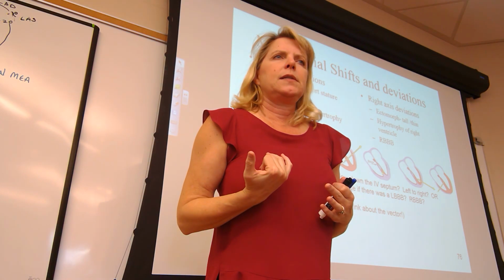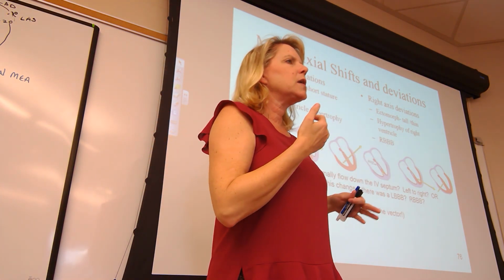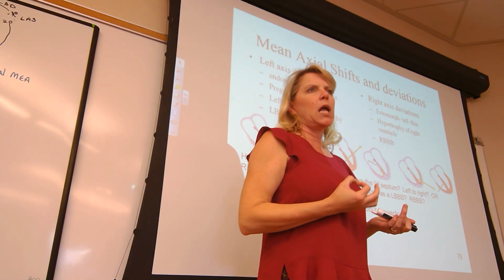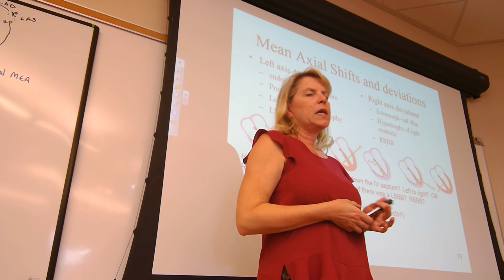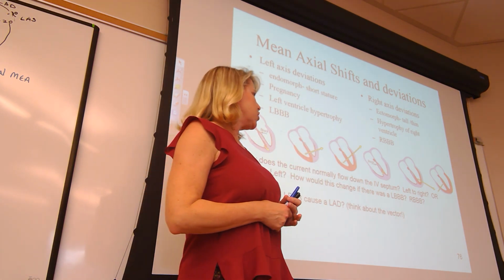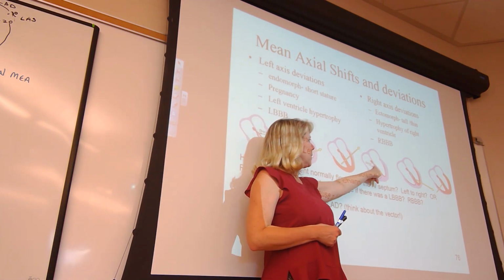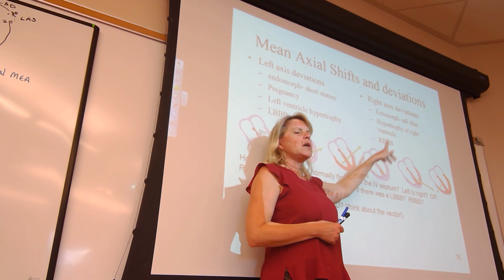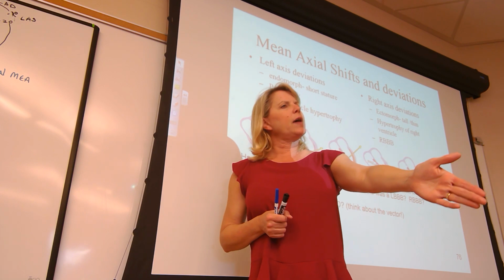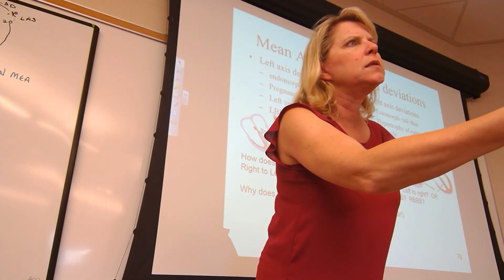But are there disease states that can lead to a right versus left? Of course. Up on the screen, I'm showing you a bundle branch block. If there is a right bundle branch block, shown over here, that means the left side of the IV septum will depolarize faster than the right. That happens normally anyway.